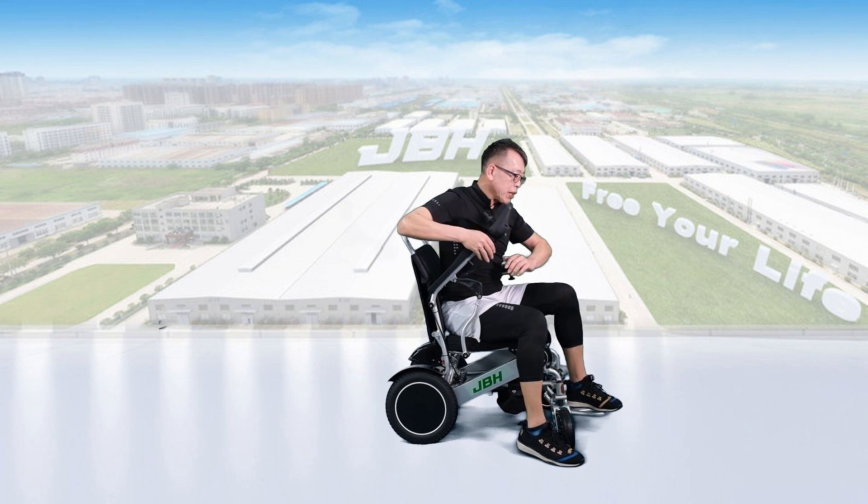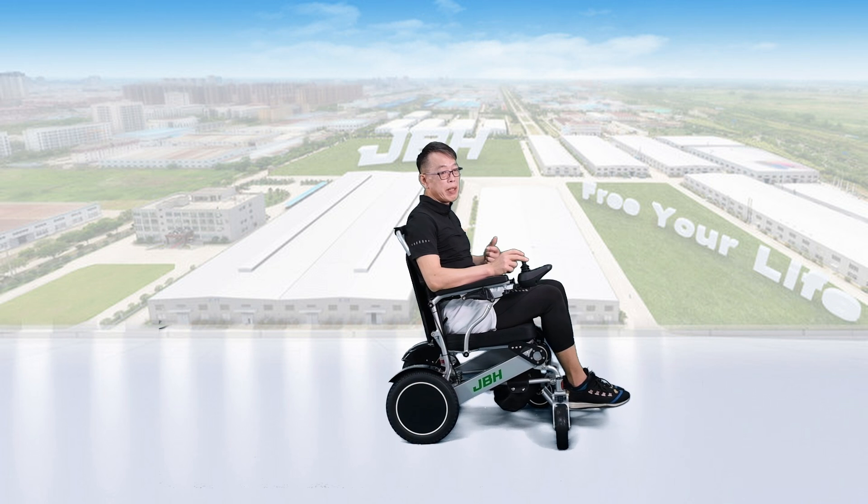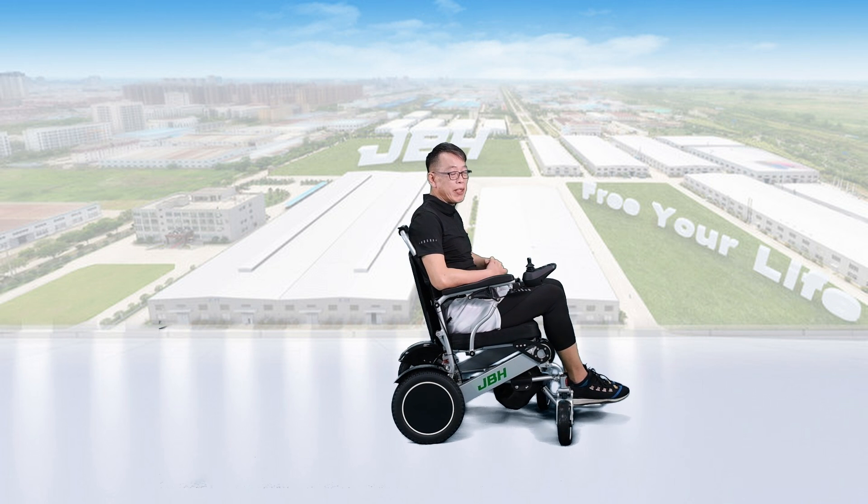Then we put the armrest down once we get on the wheelchair, turn the power on, and we can just go straight, go backward, turn left and right, even 360 degrees — no problem at all.